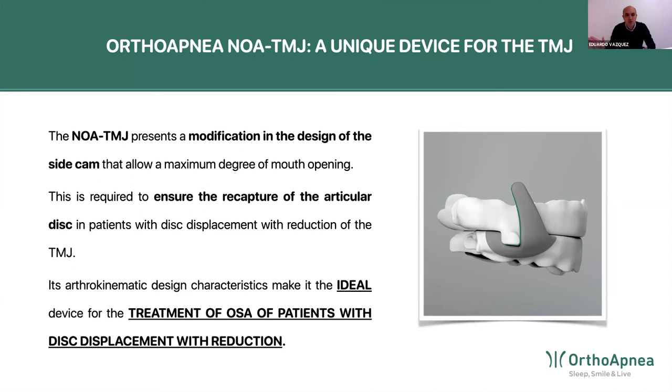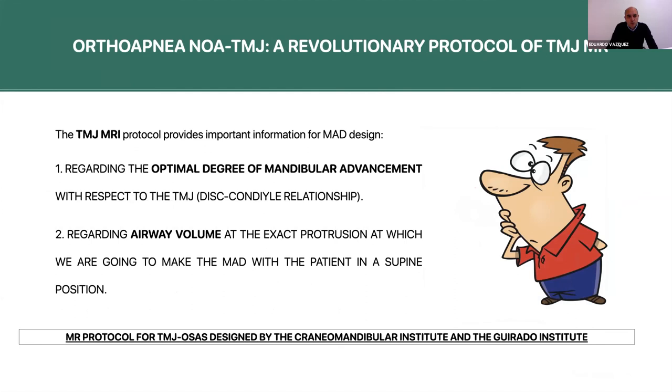So this protocol is going to allow us to decide in these specific cases, so patients that have painful clicking of the temporomandibular joint, this displacement with reduction, and sleep apnea problem, we are going to be able to treat both disorders at the same time. Now you have to think that clicking is very prevalent in the general population. So we're going to find a lot of patients with clicking in the joint where we have to use a MAD. In many cases, the clicking noise is not painful, okay? In some cases, it is painful. And if it's painful, we think that we can treat both disorders at the same time.